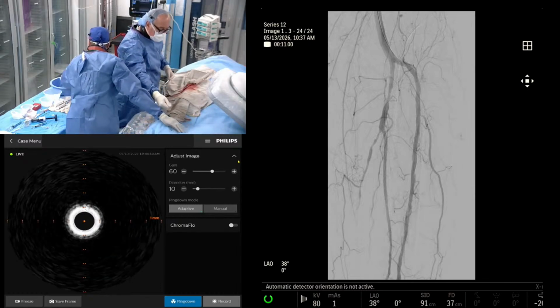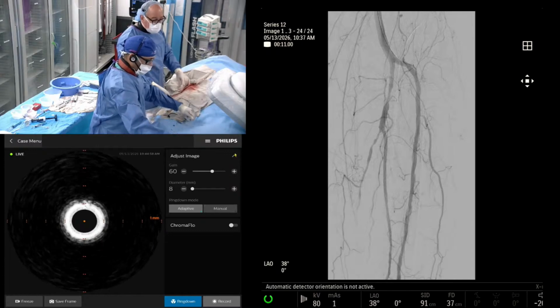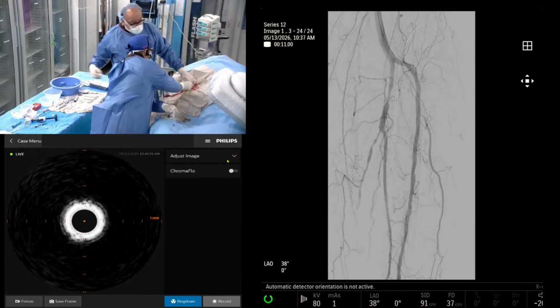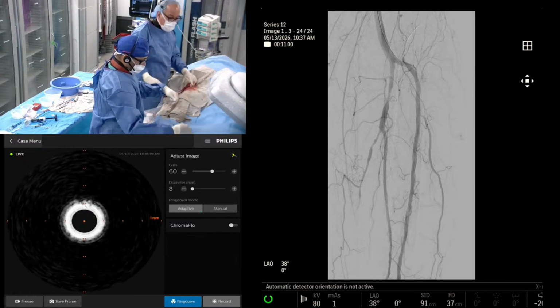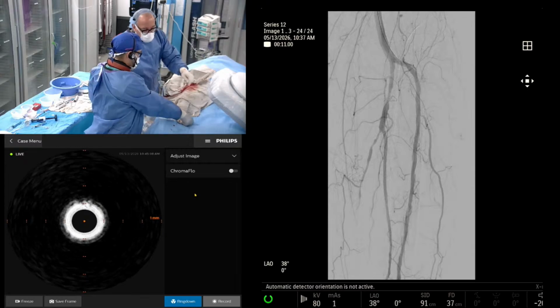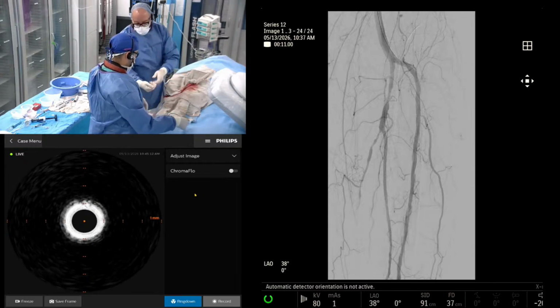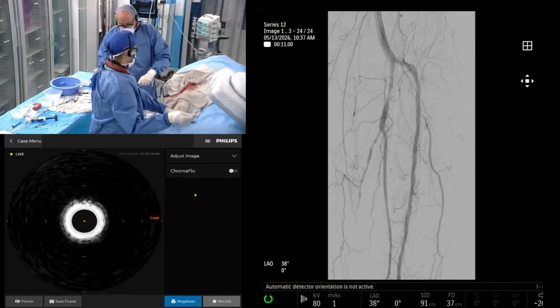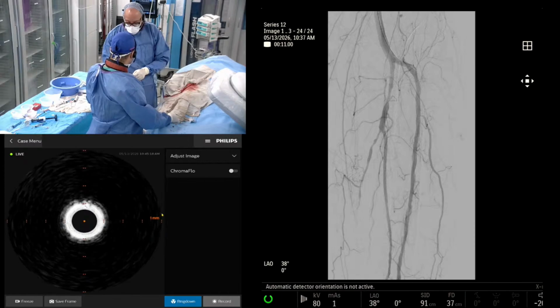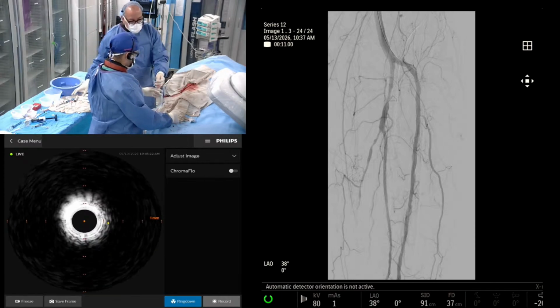All right. So I always sort of joke when you do these cases, if you could do them underwater, it would really, really help in terms of being able to deliver everything. So if you hold this for a second and give me that, I'll trade you. Perfect. And I'm going to take this, just make sure that this is really, really wet. Okay, now let's try that again.